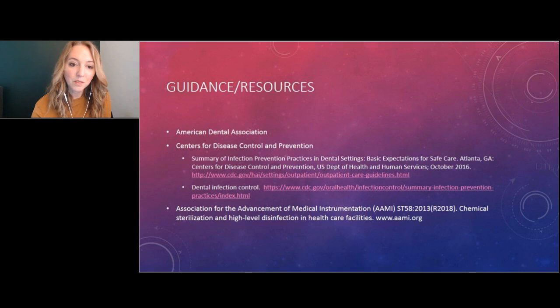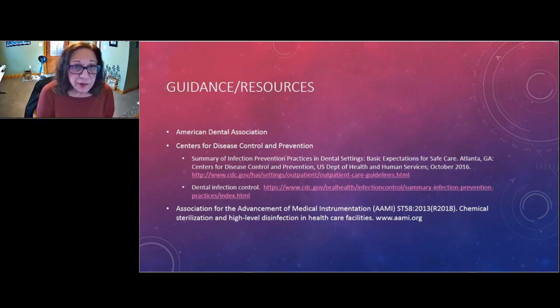Yes, always follow the IFU or DFU for the reprocessing instructions. Some device manufacturers will be very specific. Only use glutaraldehyde or only use hydrogen peroxide. Others will actually tell you a specific brand. For the manufacturers that don't mention a name brand product, they will tell you glutaraldehyde in a certain percentage or OPA in a certain percentage. And that truly is all you should be using for soaking, should you need to do that.